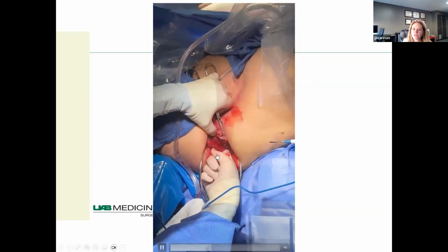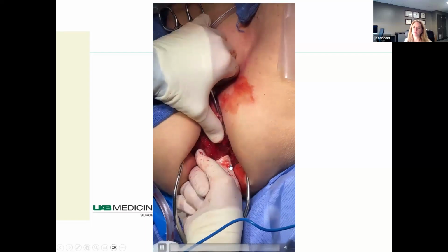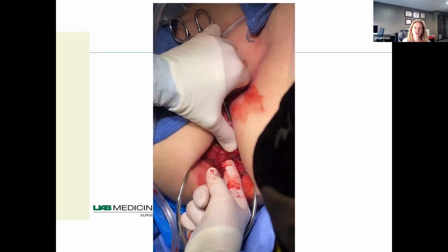But generally speaking, we always enter to communicate with the abdominal portion of the operation from the posterior approach. So you saw in the videos before, we divided the majority of the anal-coccygeal ligament anteriorly. When you're doing the perineal operation, as you're working, you should be reaching in and periodically feeling where the coccyx is. You want to make sure that you don't get posterior to the coccyx, which is an easy mistake to make. But you should be feeling where the coccyx is, and you should essentially be aiming just directly anterior to the coccyx. And if you're doing that, you should then be able to enter where the abdominal portion of the operation is. So we keep dissecting, aiming towards the anterior portion of the coccyx until we're able to poke through and feel with the finger, as you see here, where they communicate.